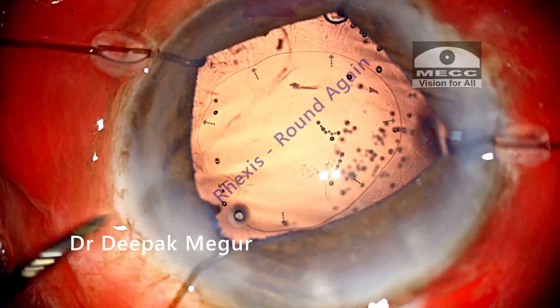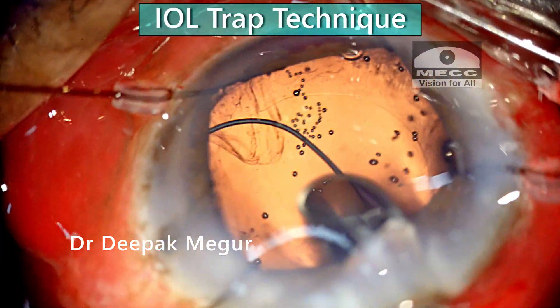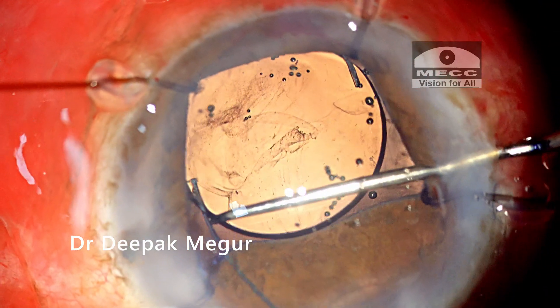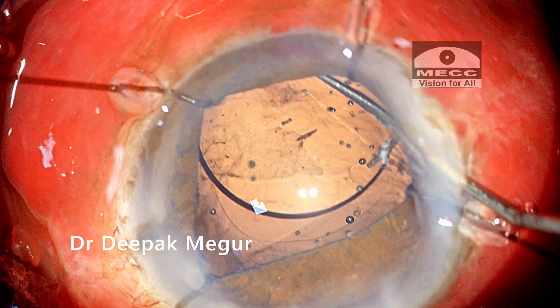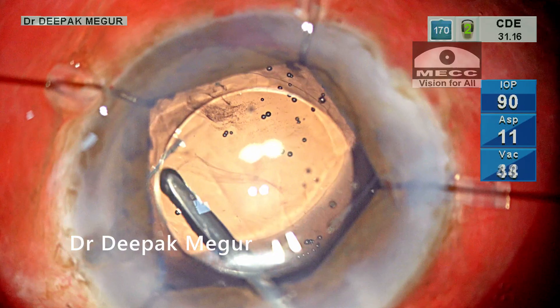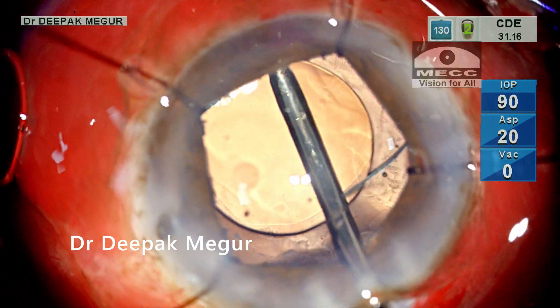We can now see that the rhexis has regained its circular configuration. For IOL implantation I have planned to use the IOL trap technique, implanting a multi-piece lens into the sulcus and then achieving optic capture. The leading haptic is placed over the anterior capsule, the lens is gently dialed in, and both haptics are positioned in the sulcus. The OVD behind the lens is then aspirated out.